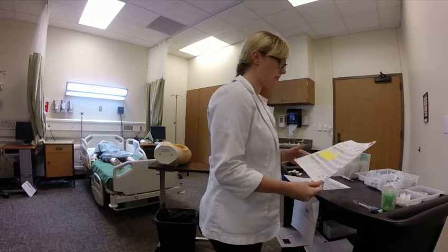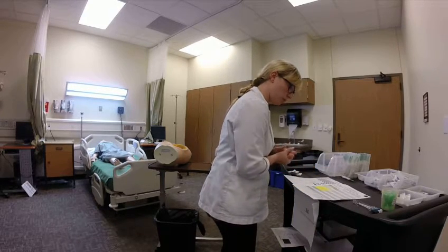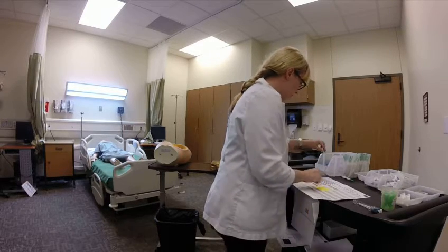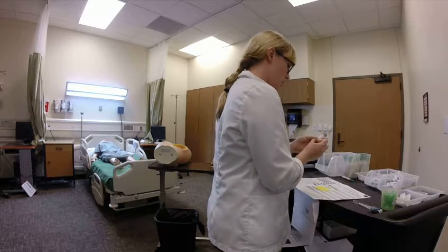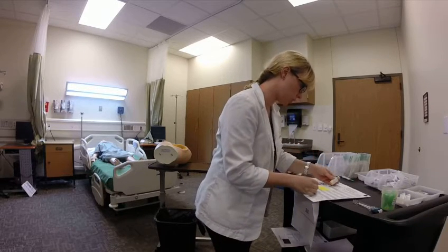First check, pulling my med out: Rocephin 250 IM Q12 hours times two doses. It is 9 a.m. in the morning, so I'm going to pull that medication. I have it here — it is the powder. I have one gram Rocephin, expires 3/20, and I will be adding sterile water to this. This is my first check.